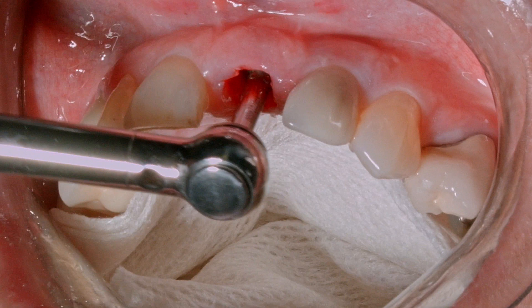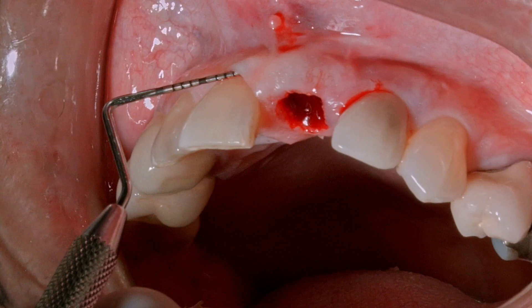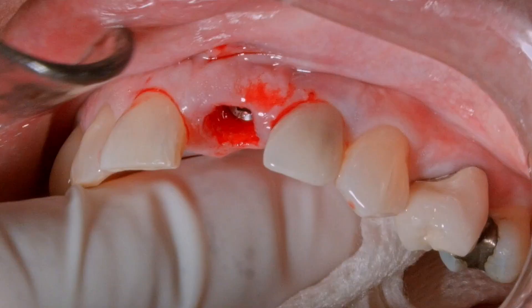The hand ratchet is used to confirm the stability and continue to place the implant to the desired depth. In this case a healing abutment is placed, and then soft and hard tissue grafting using a minimally invasive technique is provided. Here's the post-operative radiograph.